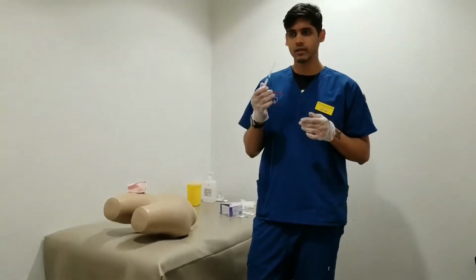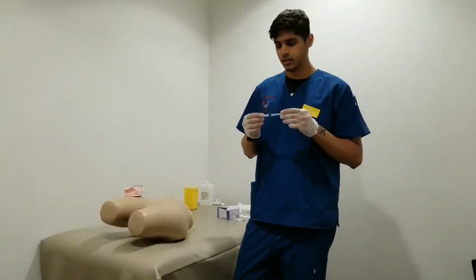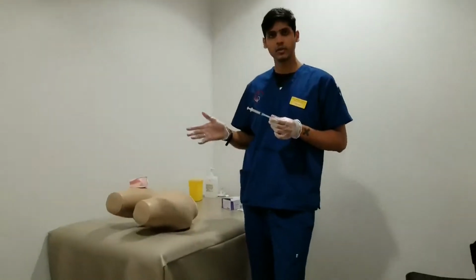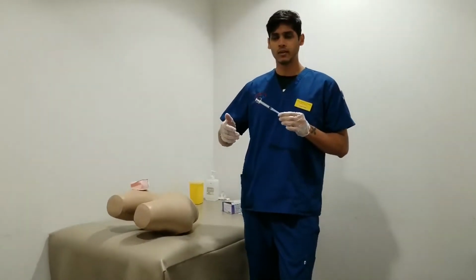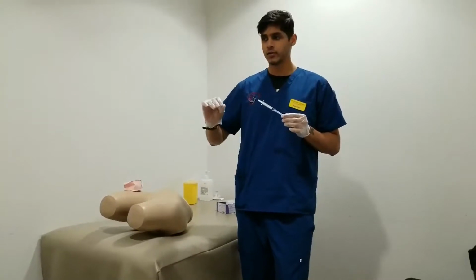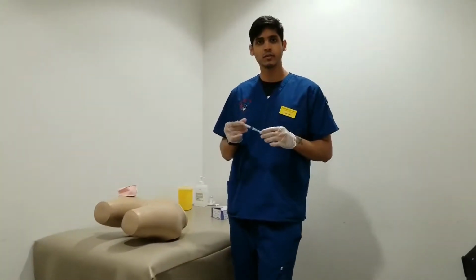Hence why we have a smaller gauge, which is a thicker needle. Anyways, the angle that we're going to be administering this medication is at a 90-degree angle. Since we want to go past the subcutaneous layer, go right past all the skin, integumentary, and go into the muscle.